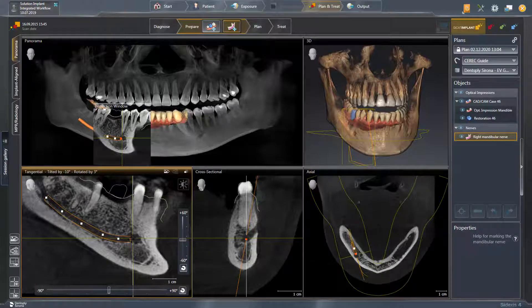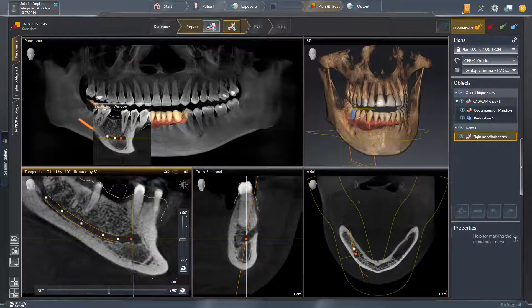Shortly before the lowest point of the visible nerve path, we set a further nerve point in the tangential view. Then, switch to the cross-sectional view where we will mark the last nerve point with a double-click, immediately at the place of emergence of the nerve — the mental foramen.